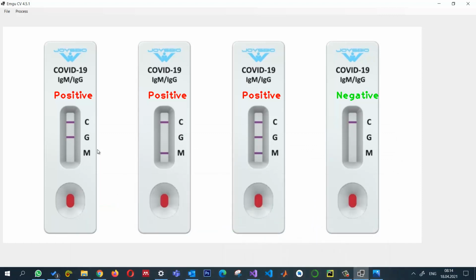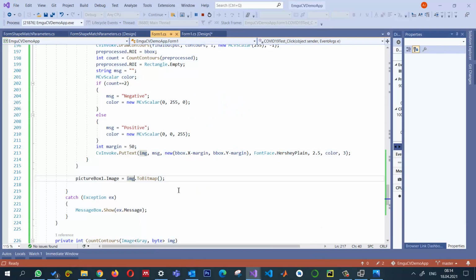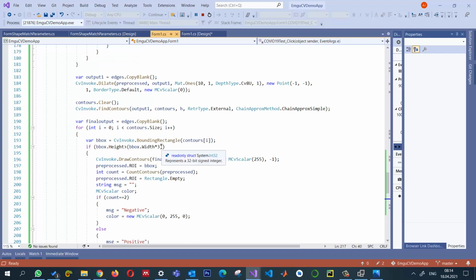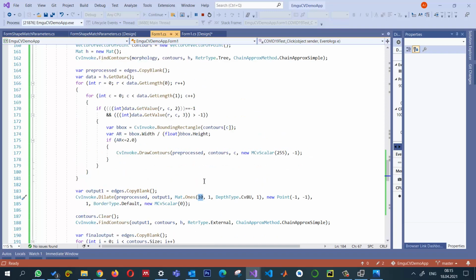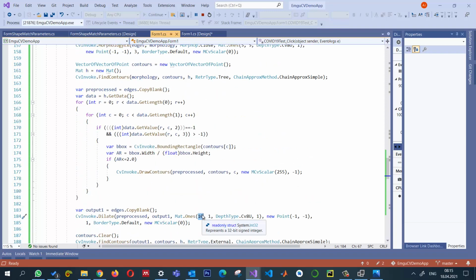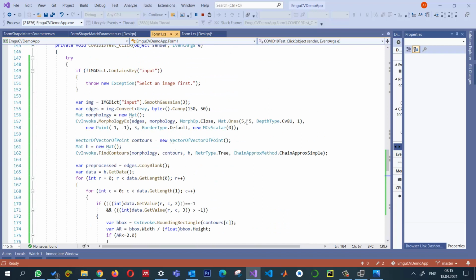So one thing, remember that if we change the size, there are many things that I have used here with the fixed values, for example, multiplication with this one. So with changing the size of the image, we may need to do it dynamically. For example, for the pre-processing of this dilation, and for the closing, we have selected these things. But if the image is changed, then we may need to dynamically change these values. So that's it for now, and hope to see you in another video.